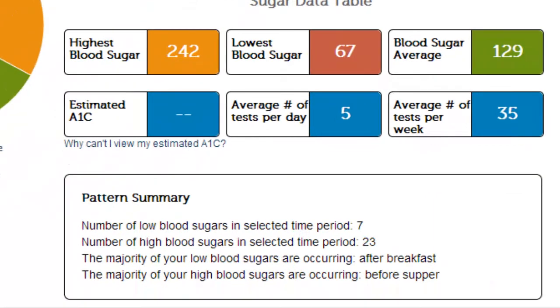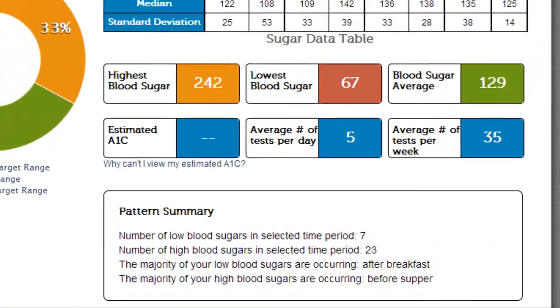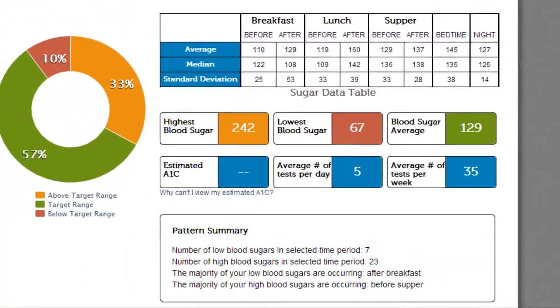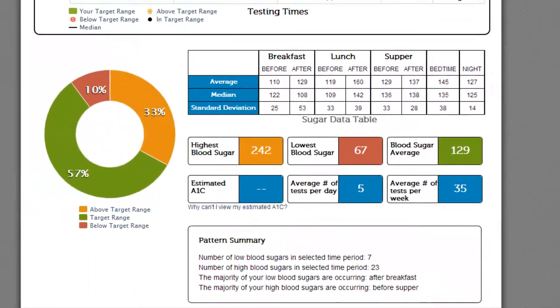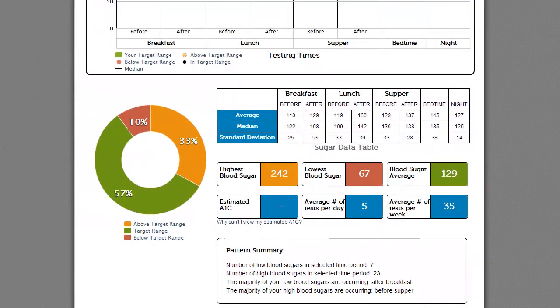At the bottom of the page is a pattern summary. You'll see the number of low blood sugars, the number of high blood sugars, and what times of day they are occurring the most. This may help you and your doctor come up with adjustments to your carb intake or medications.